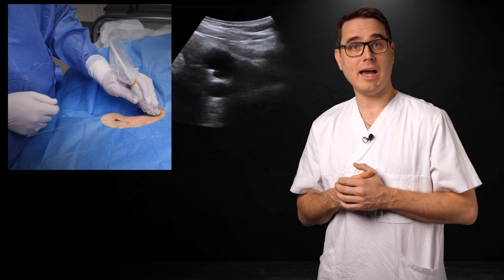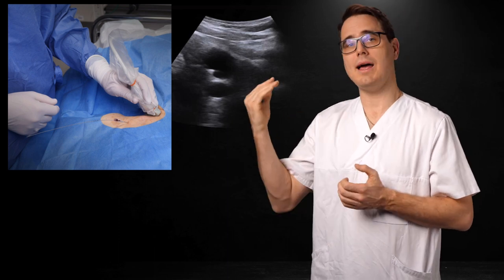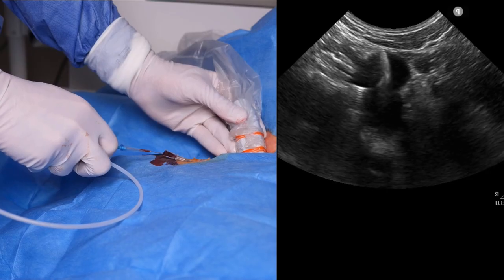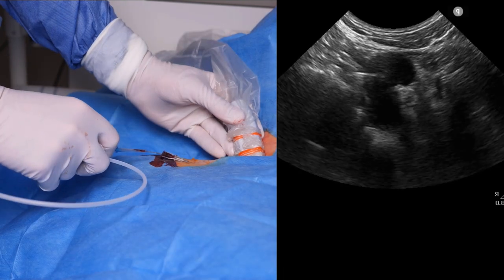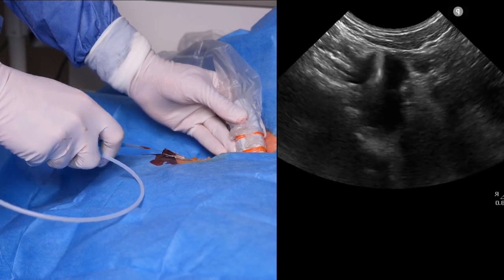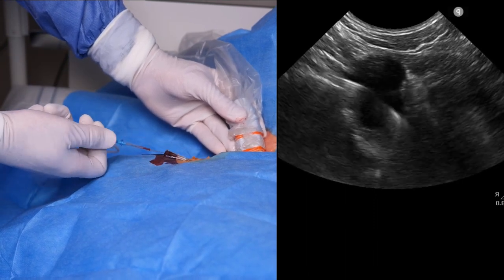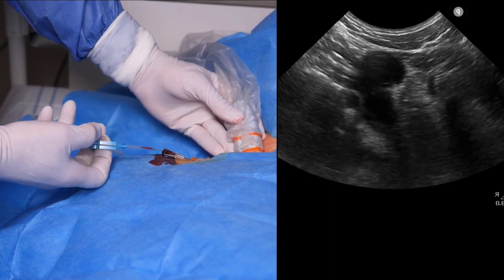So, what do you do if your subclavian guide wire has deviated upwards into the IJ or across to the left brachiocephalic veins? Well, you adjust it in real time — and this is where the supraclavicular fossa view is unbeatable. This is a cross section of the IJ, and the hyperechoic dot is not supposed to be there; the guide wire deviates cranially from the subclavian into the IJ. The guide wire can be repositioned to the superior vena cava by retracting it into the loop, locking it with the thumb, rotating it 180 degrees, and reinserting it.